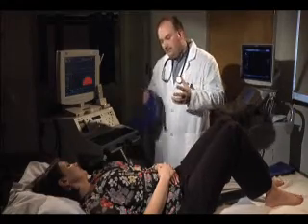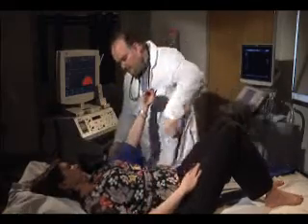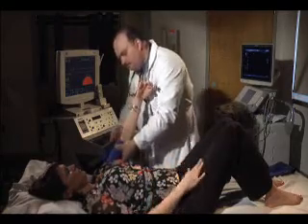So basically this is for blood pressure. And then what would be the next step if you determine there was a blockage? Do you have more testing?